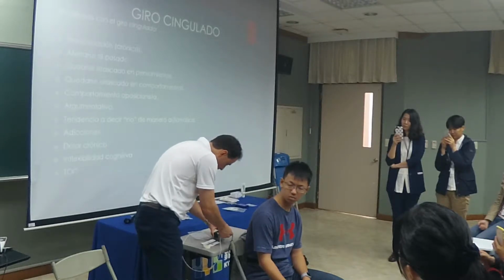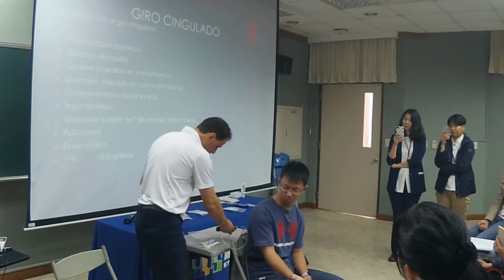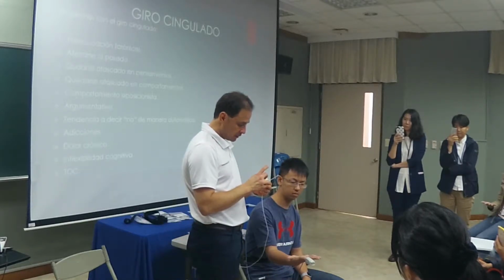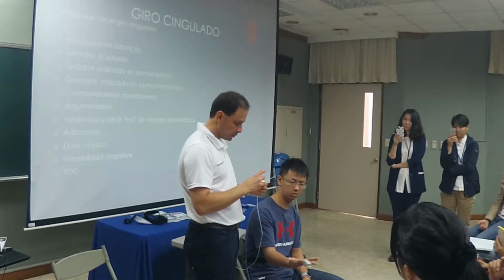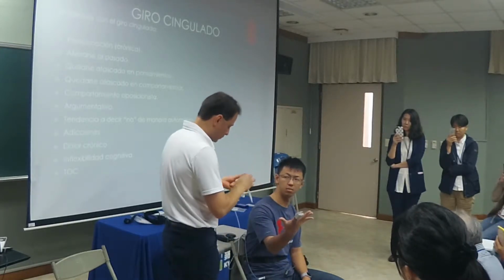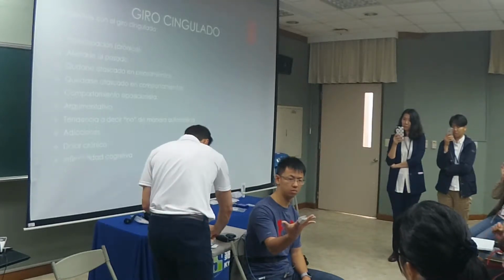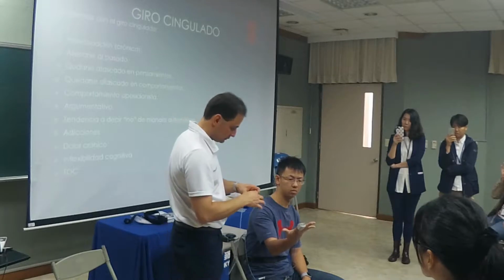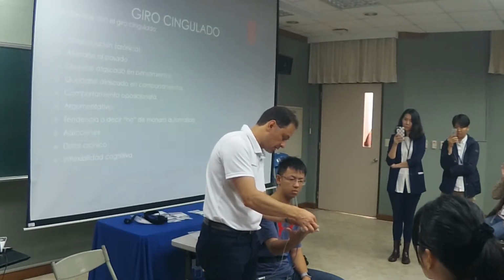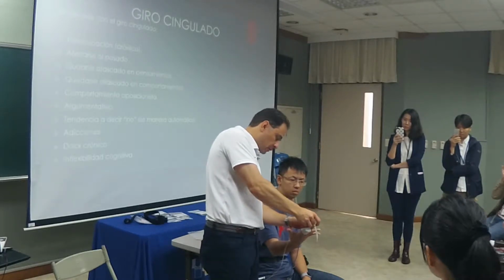Red dot with the red dot, and it slides in nicely. We're going to raise your hand for this. A little more, please. Get your hand high, please. There. Remember, it goes against the skin, because you don't want to record room temperature.